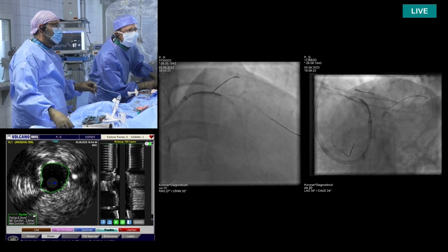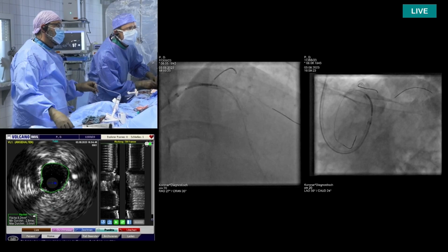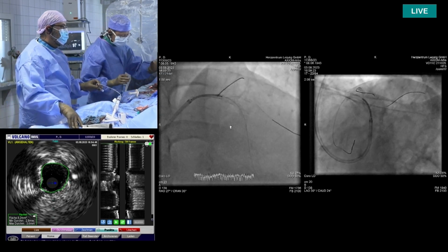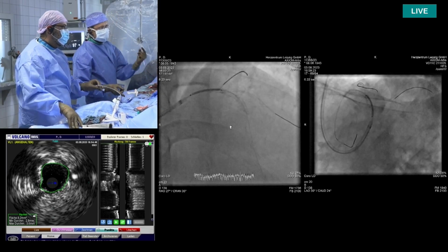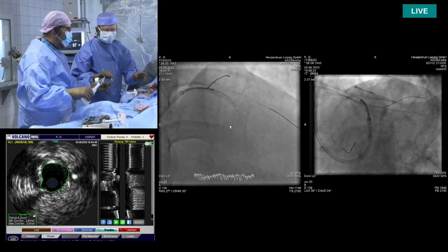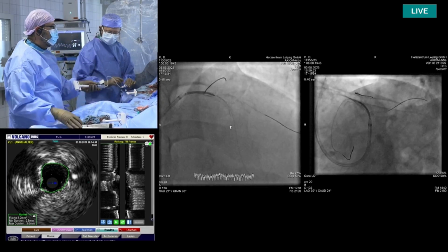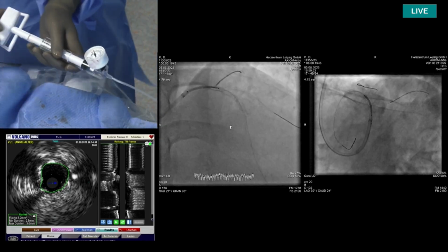So again, just for the audience, because this stent is not yet available, I think, in Latin America. I know it's not available here in Brazil, but it's a new generation stent that is purposefully built for large proximal vessels because it has thicker and wider struts. So it only comes in sizes of 3.5 up to 5, and it overexpands well up to 6 millimeters because you have more crowns on each ring of the stent.